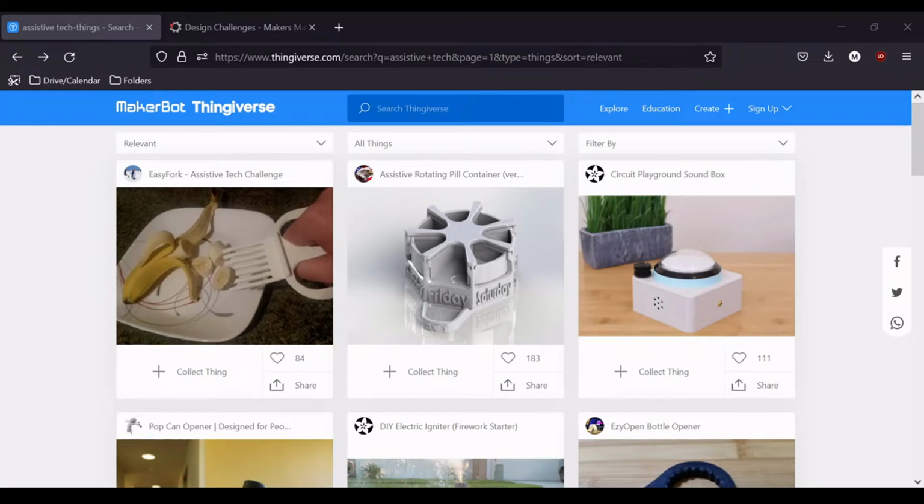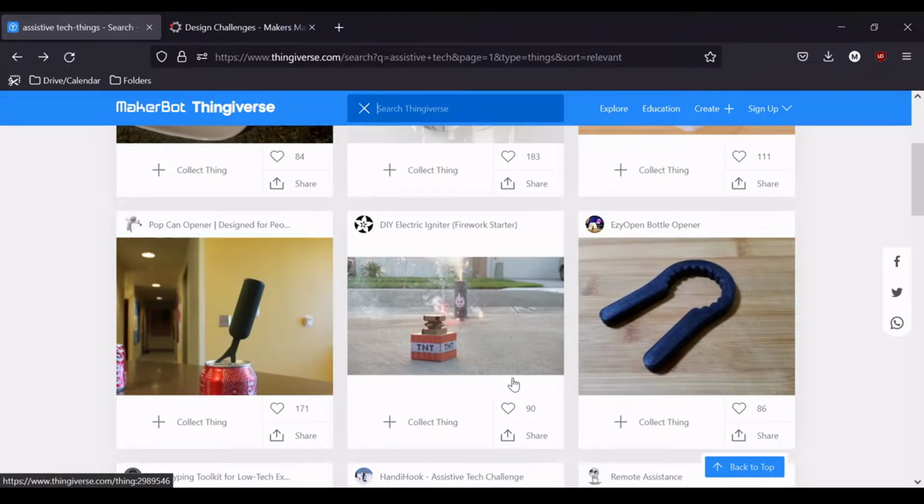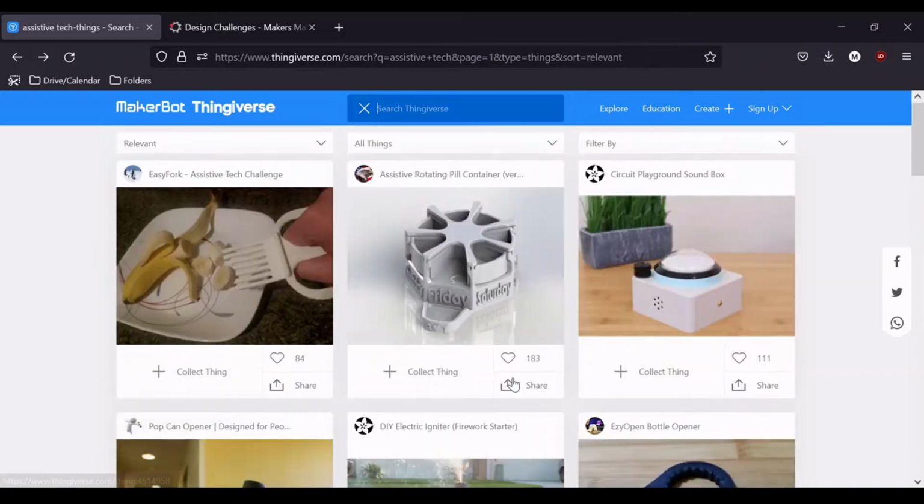So just to start out with an example for today, let's go to Thingiverse and find a design that suits our needs. If I happen to be, let's say, an individual who has difficulty opening soda bottles and other things that have that kind of nature, there are solutions that individuals have already uploaded. A good general rule of thumb is the more common that an issue is in the general public, the more likely you are to find a solution here on Thingiverse.